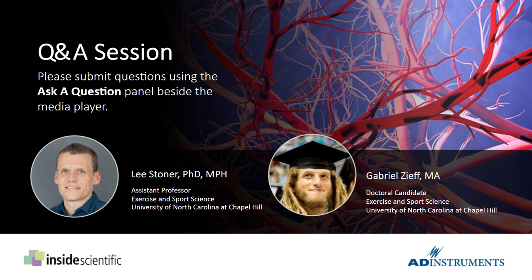I would just add that I think the acute exercise scenario is a great example of a situation in which we really want to consider when and how we would want to measure pulse wave velocity. If we're still in such an acute post-exercise phase that we still have a lot of sympathetic nervous system activation and we're still riding an elevated blood pressure, well, that's going to affect our arterial stiffness measure. So, thinking about, okay, we do want to look at the acute effects of exercise, but how soon after that exercise bout do we want to measure stiffness? So just another good example of those methodological considerations and study design considerations.